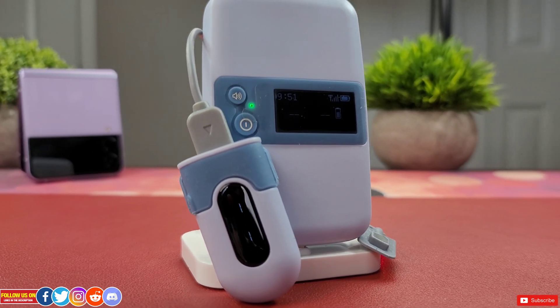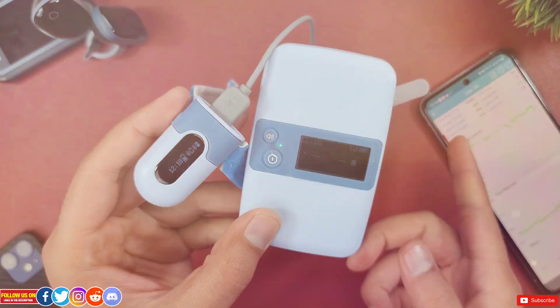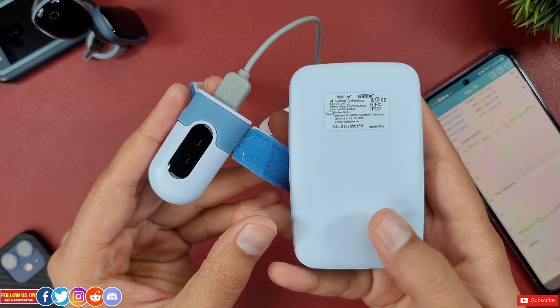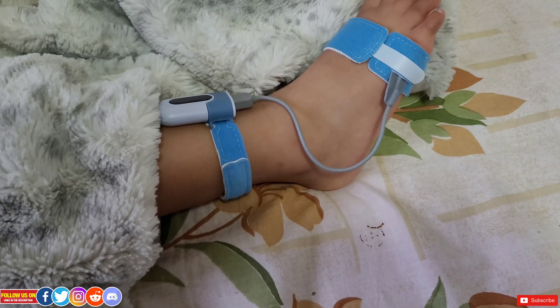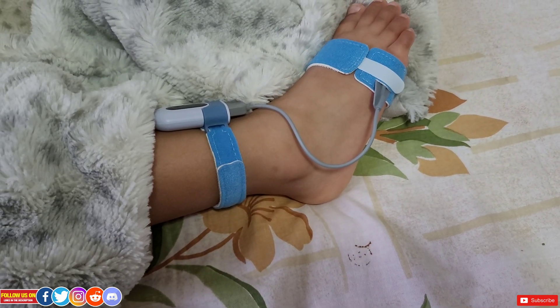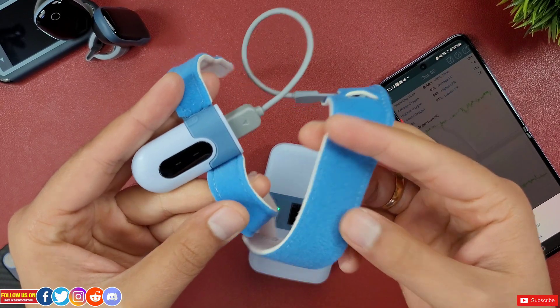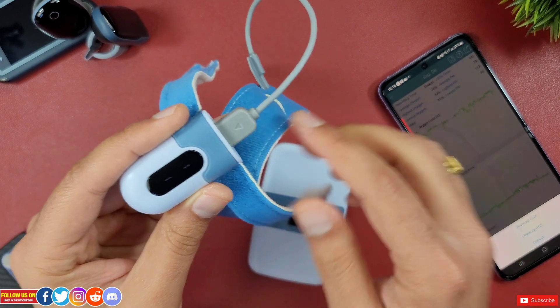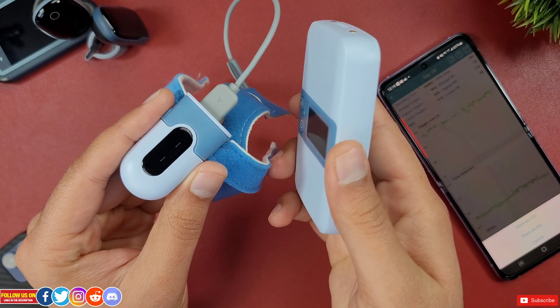Final thoughts: the Baby O2 S2 oxygen monitor is a very unique device with robust quality and a great app experience. If your child suffers from any pulmonary condition, talk to your child's pediatrician about using this device to monitor levels and export concerning results to the doctor. The fitting is amazing — no matter how much your child moves in the crib, the device will not come off. Since it's on the foot, there's no risk of entanglement, and from testing, my child did not even wake up with it strapped to her foot.